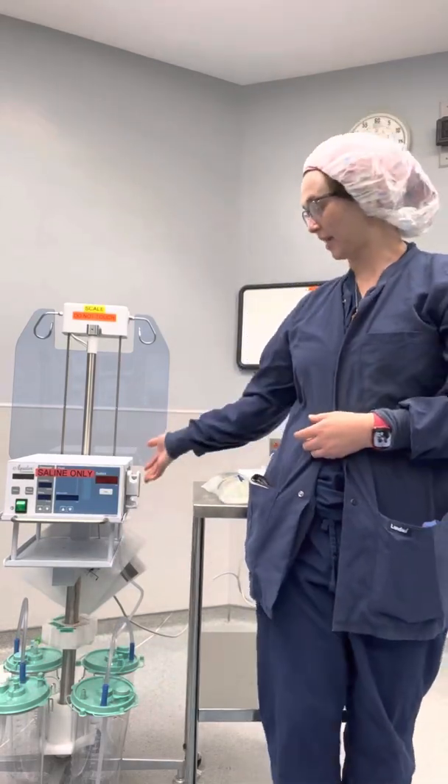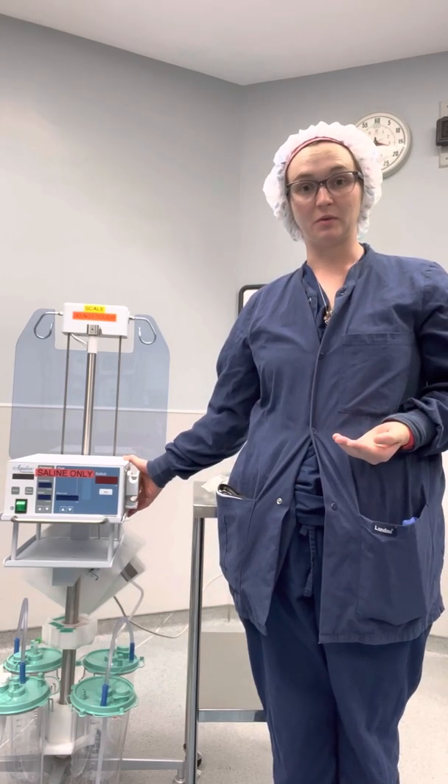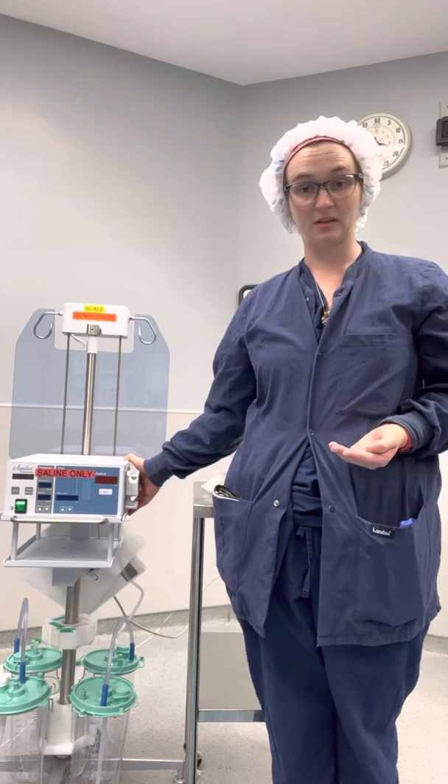Today we're going to put together the Aqualex Fluid Management System by Hologic. This fluid management system is typically used with the MySure Morcellation System.